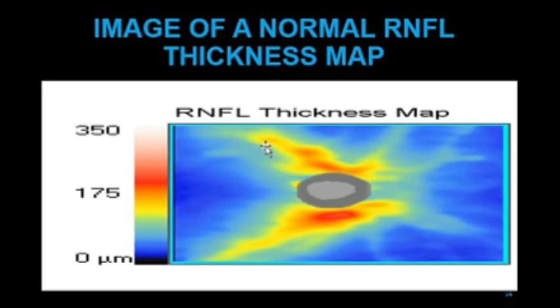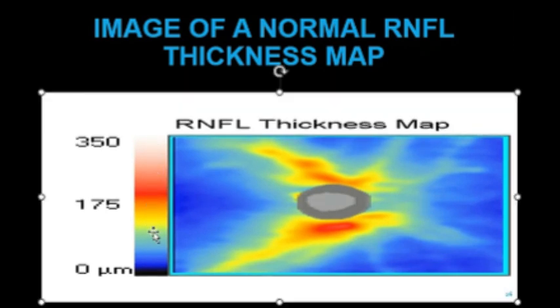So the retinal nerve fibers will appear as butterfly or wing shape. What we mean by butterfly is this, where my cursor is going; you can see it also below. This is how a normal retinal nerve fiber layer thickness map will appear, and this is the color coding. From here to somewhere here, that is from red, if you notice, the color changes as it's going down. Anything blue is showing bad results, and black is showing extreme cases where there is a loss.